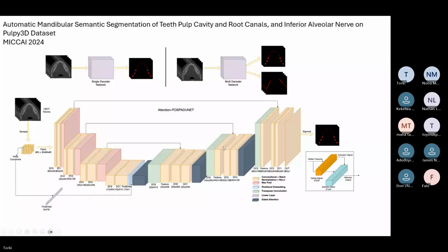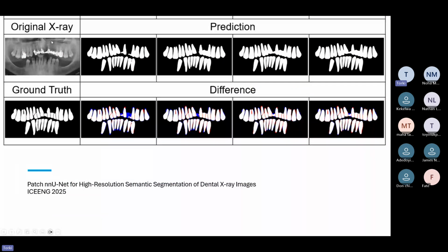Okay. Another work, but on 3D volumes. So this one was a fully supervised learning approach. The learning paradigm here was supervised learning, and we had 1,600 panorama X-rays coming from publicly available datasets.